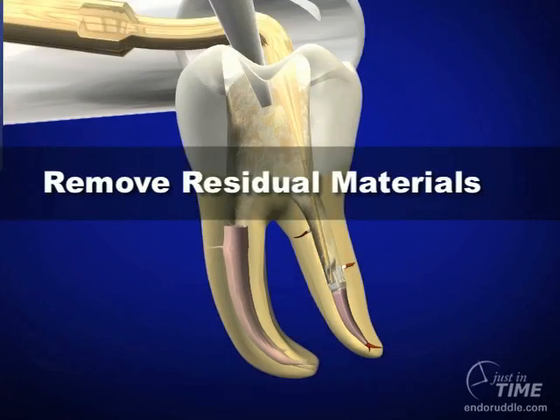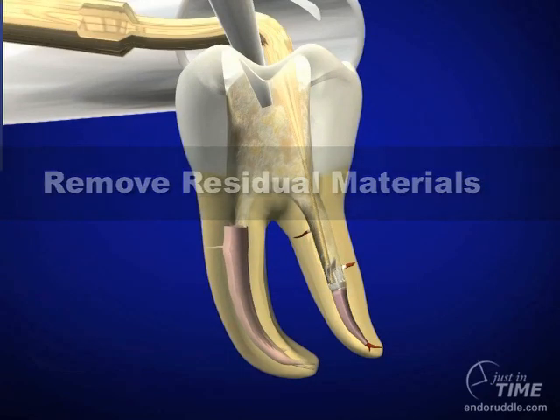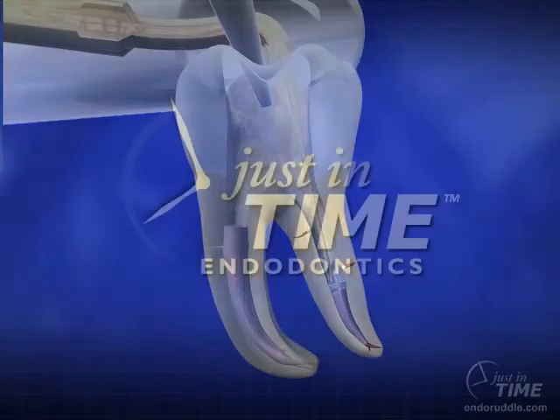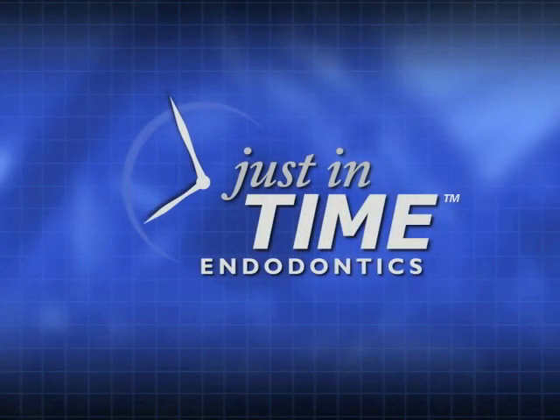Once the post has been completely removed, use a longer, thinner, more tapered tip that will reach to the apical extent of where the post used to be, and we can use this ultrasonic tip to remove residual materials. Post removal has become quite routine, and even in the advent of adhesion dentistry, the good news is most posts can be removed in about 10 minutes after they've been fully exposed.